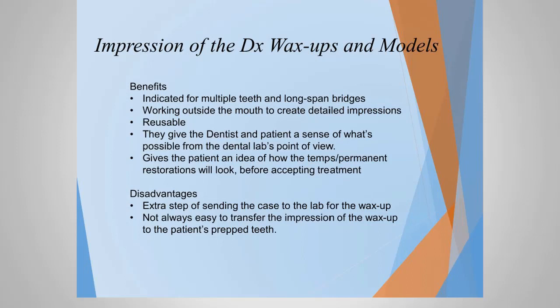Well, what the diagnostic wax-ups do give those patients is an idea of what the work is going to look like, whether it be the temporary or the permanent restoration. The disadvantage of these diagnostic wax-ups is there's an extra step that we have to take in terms of taking an impression and sending it to the lab.